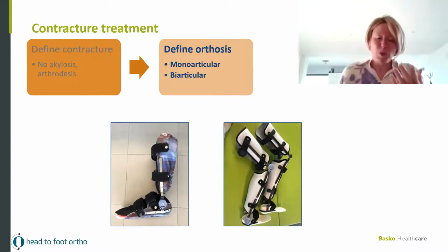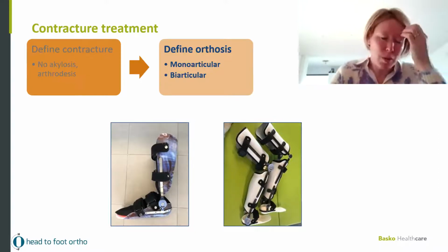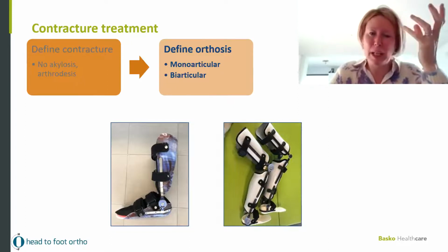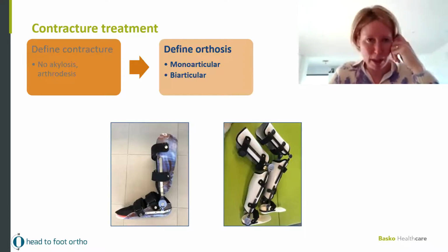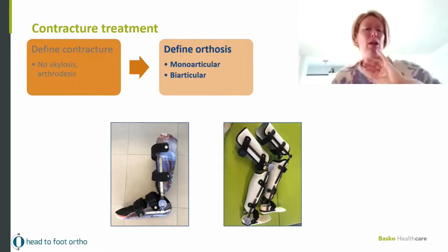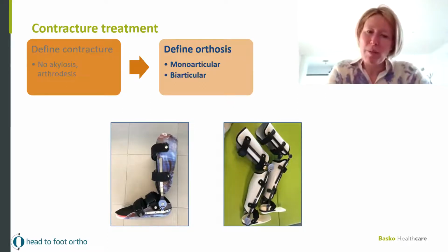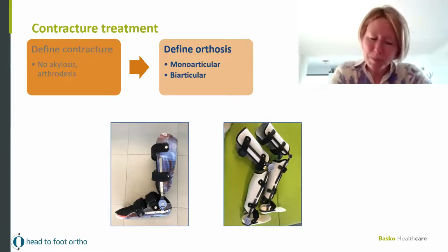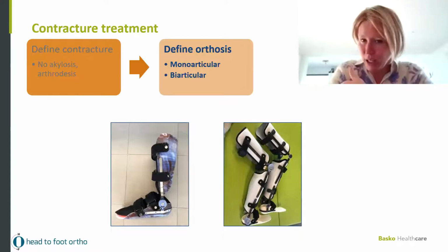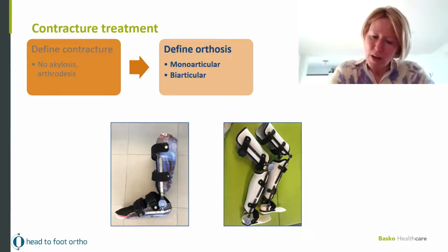So, well, you always do the anamnesis and you just feel the patient, what's happening. So by just putting my hands on both legs and manipulating them, he was shooting me with his eyes. And I was like, doctor, if we apply, for the beginning, a biarticular orthosis, biomechanically 100% fine, I'm not sure he is going to accept it. And why not choose to cut the orthoses? We didn't cut the orthoses, but cut the concept and make just a knee orthosis and an ankle orthosis. So during the night, we put the KOs on with multimotion.